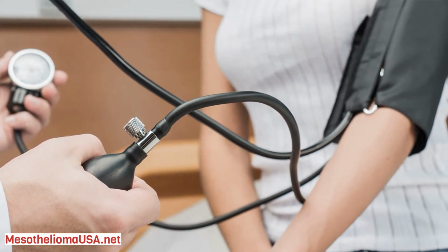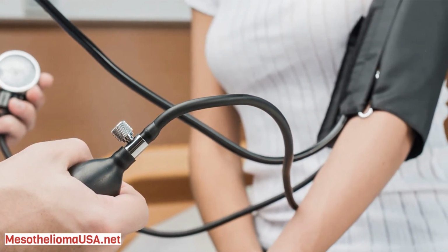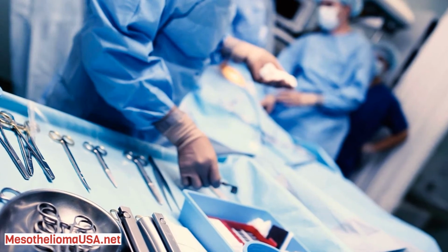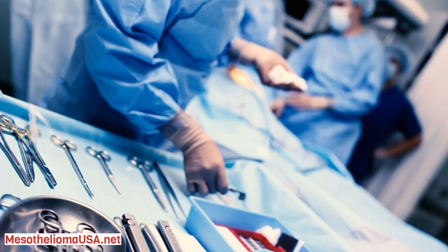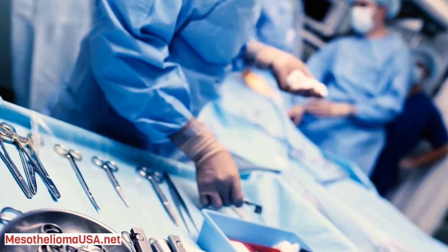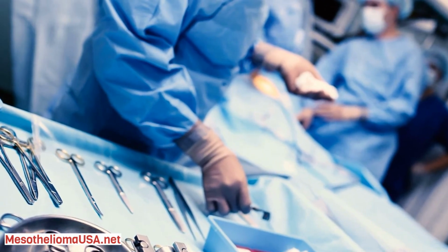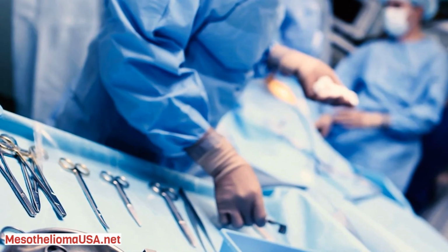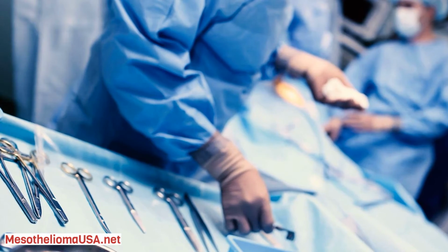Massive pleural effusion, P equals 0.003, and parenchymal infiltration, P equals 0.03, are significantly more common in metastatic pleural disease as well. Therefore, they should be considered as important findings to differentiate these two diseases and parameters leading to the diagnosis of metastatic carcinoma of the pleura.